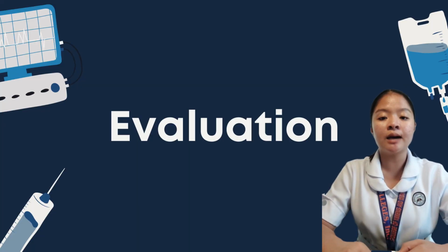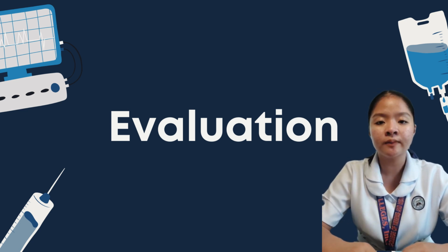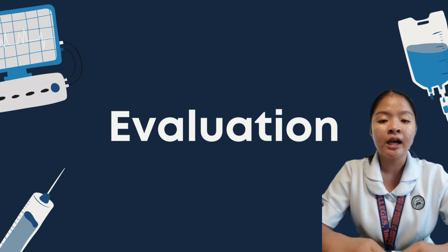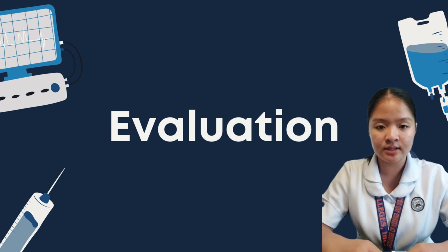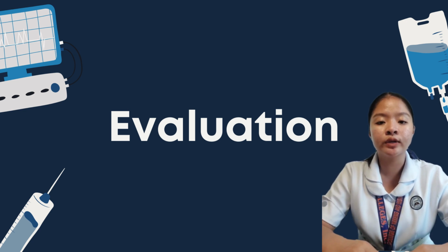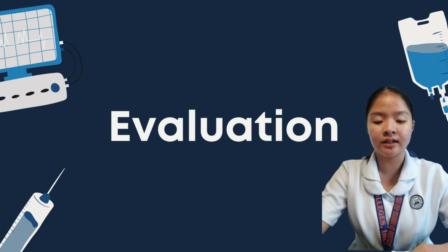In the appropriate receptacle, we need to note the amount and character of urine before discarding it. After that, we are going to perform hand hygiene. After doing those procedures, we need to record the date, time, amount of urine withdrawn, character, and the patient's reaction.